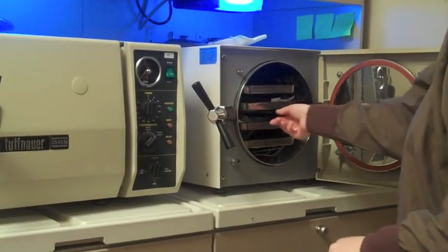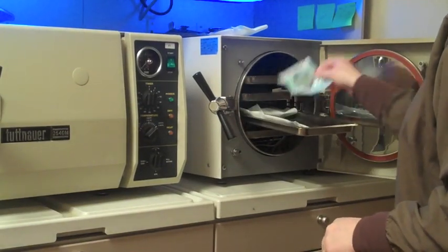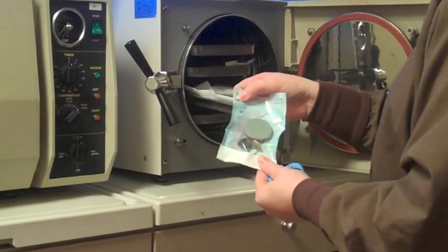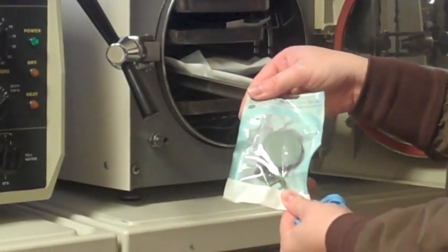Once the autoclave cycle has been completed, those instruments that are now sterilized in the pouches have an indicator on it showing that the sterilization has been completed.